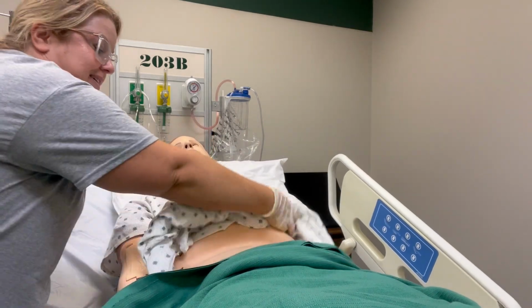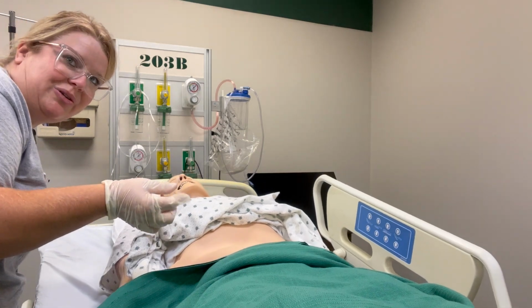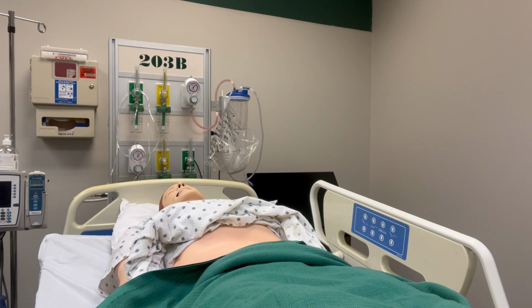But I'm just going to explain to the patient that I'm going to pinch some skin, some fatty tissue, and that's where the medication is going to go. And it really isn't a big, painful injection. So they shouldn't have a lot of pain during this.